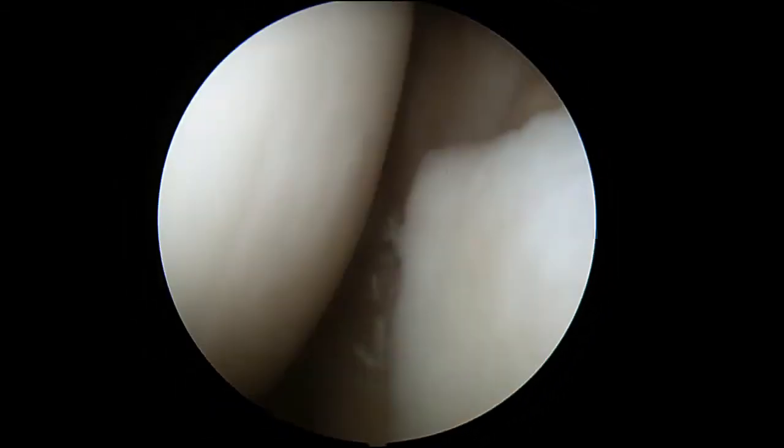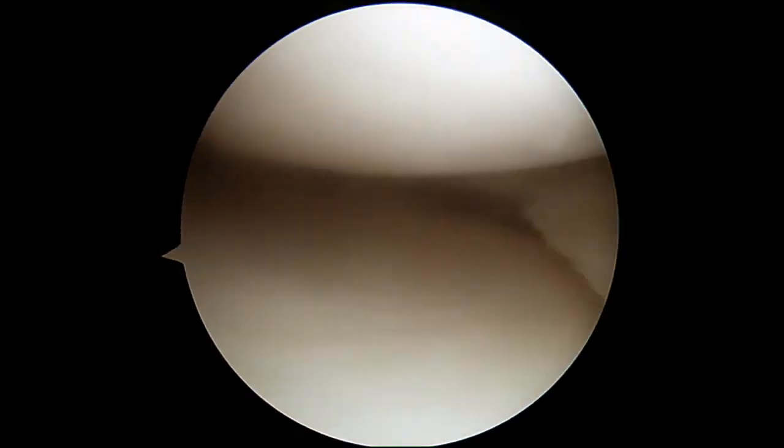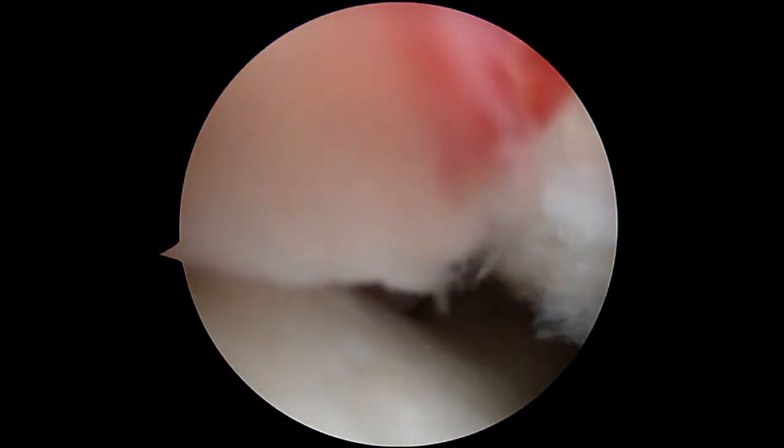So we're all done. We addressed the torn meniscus as the main problem — there it is there. Looks great now. Should not be a problem.